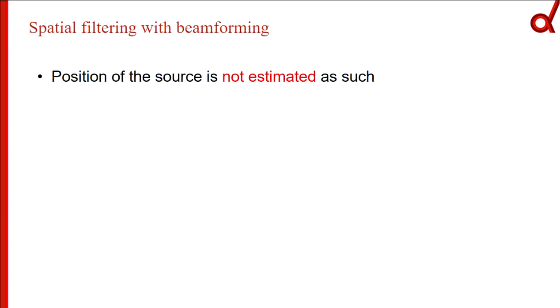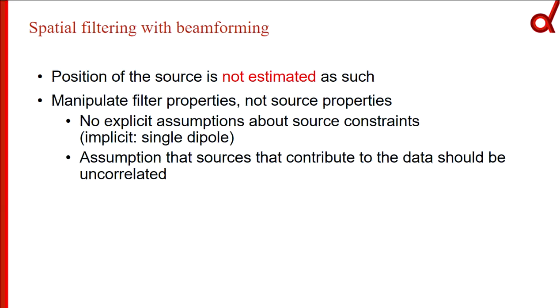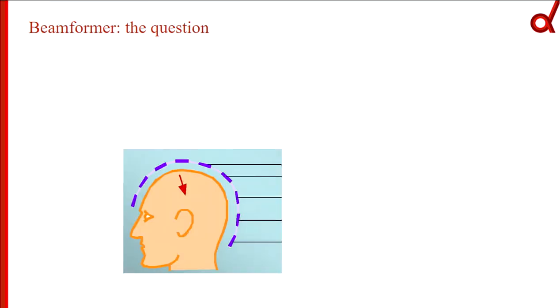We are not estimating position per se again, but what we do is we manipulate filters at the source level, which try to explain the data we have in there with some assumptions. So let's go for how to do it.